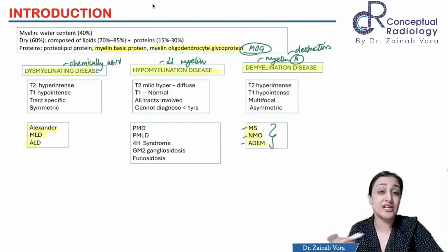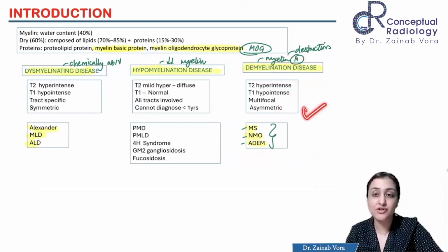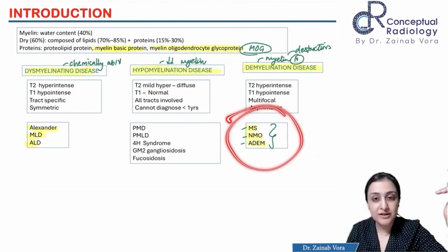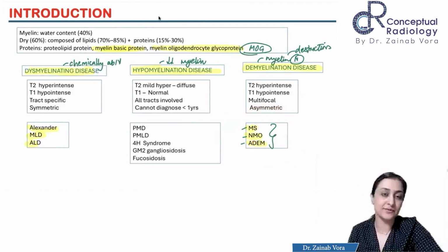So that's your vascular demyelination. That's the biggest challenge that we have: is it inflammatory demyelination or is it vascular demyelination? And all of those questions we have to learn today, that within inflammatory, how do I distinguish these three spectrums, and how do I distinguish from vascular, and then a few other differentials that we learn along the way.